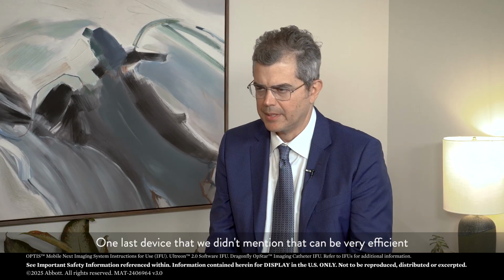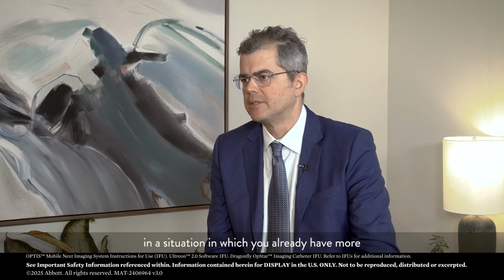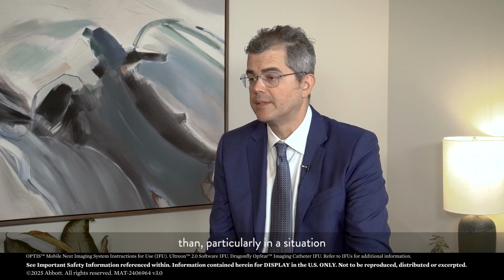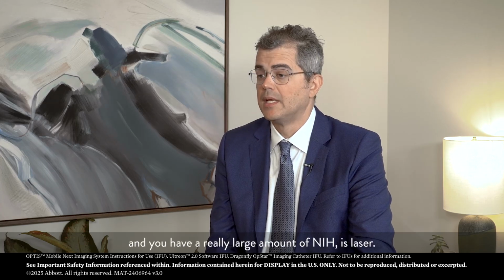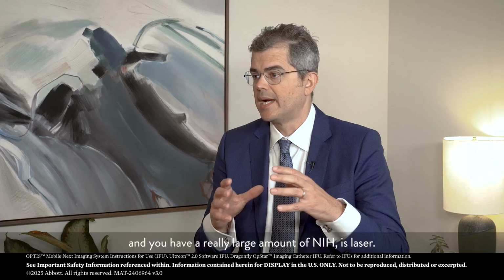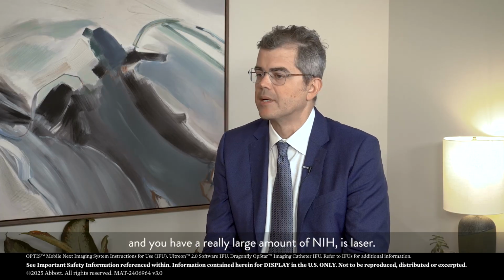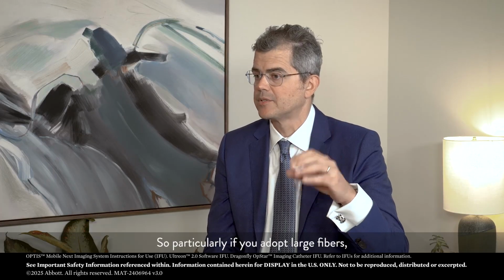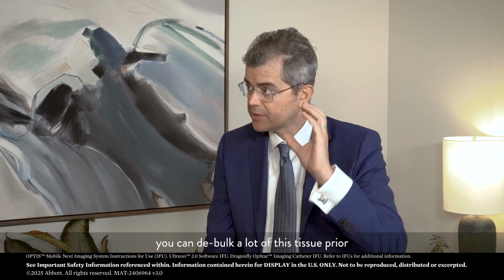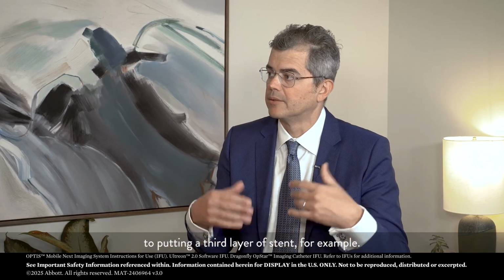Right. One last device that we didn't mention that can be very efficient, particularly in a situation in which you have more than one layer of stent and a really large amount of NIH, is laser. So particularly if you adopt large fibers, you can debulk a lot of this tissue prior to putting a third layer of stent, for example.